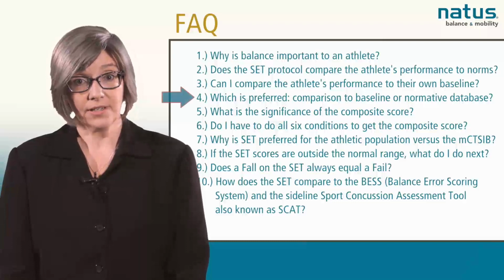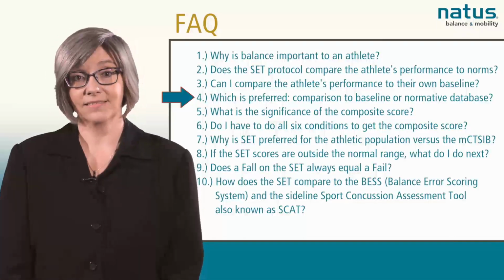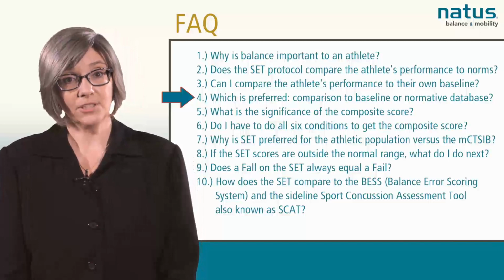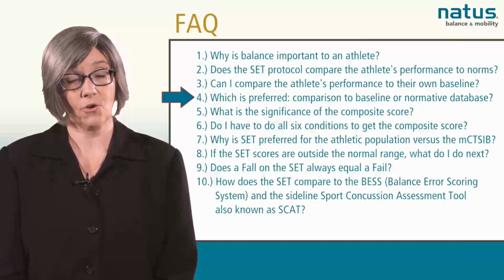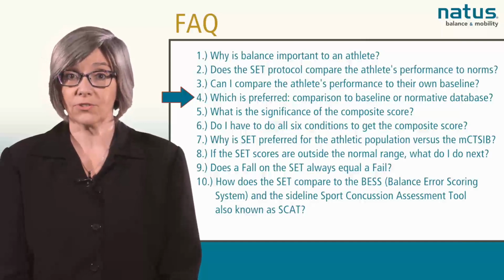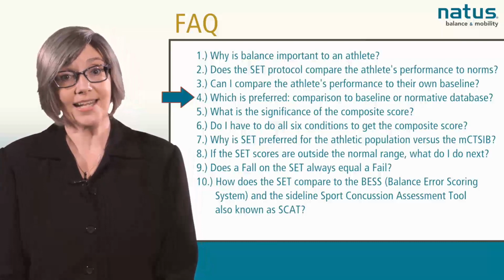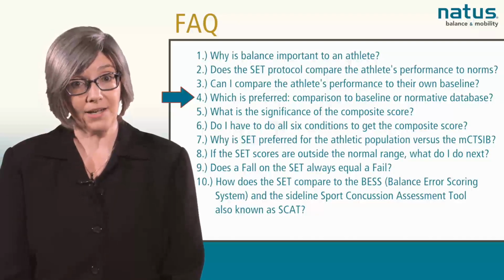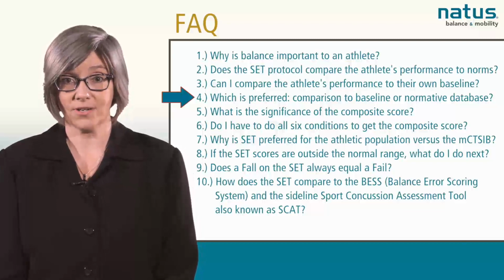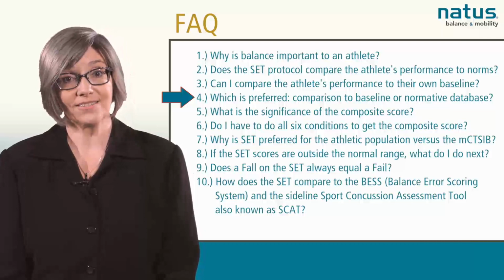Which is preferred, comparison to baseline or to the normative database? Published research has argued that the best indicator of changes in balance control is to compare individuals to their own baseline. With the SET protocol, the clinician can easily determine whether the athlete is progressing back to or better than their baseline SET scores, and/or how that performance compares to their peers.